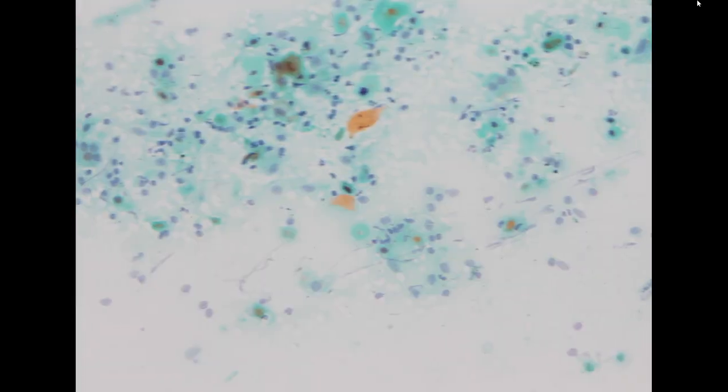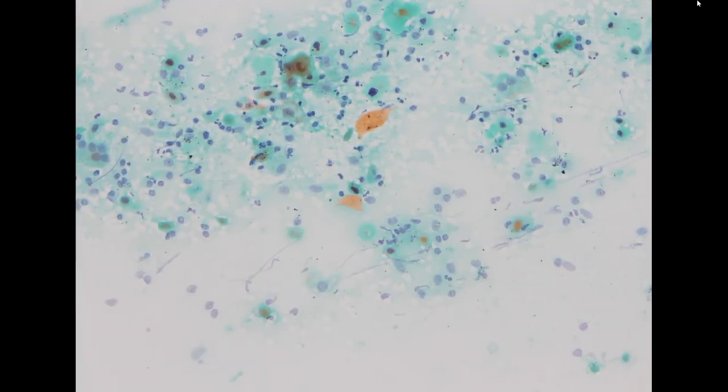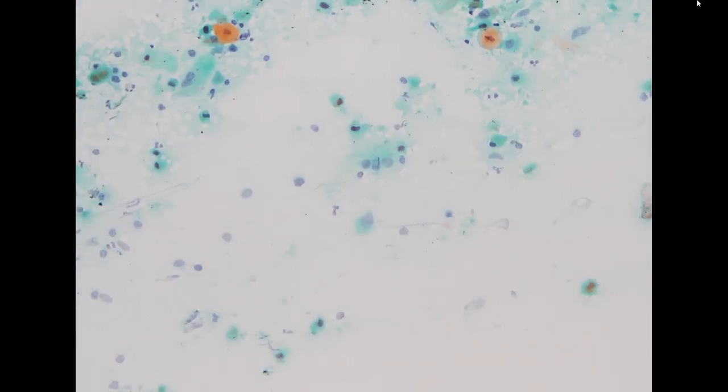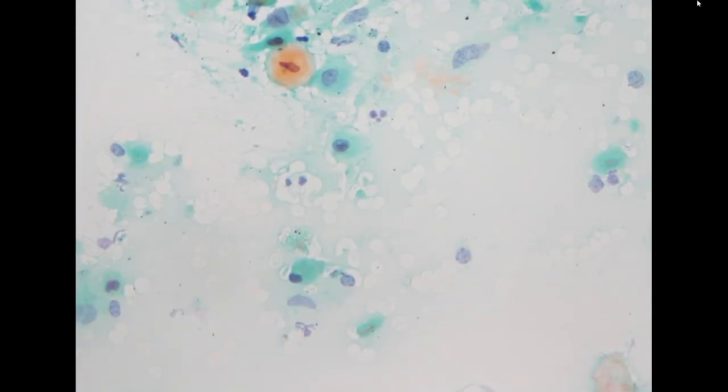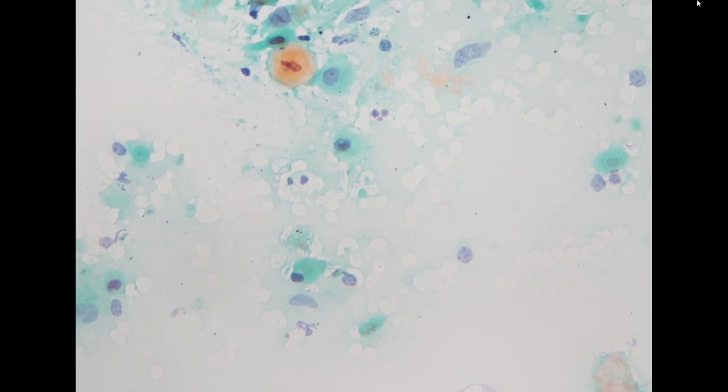So if it's a primary lung cancer, it is highly likely it is a squamous cell carcinoma, which is much less common than adenocarcinoma. However, the patient has the clinical impression of a kidney tumor, a kidney mass, which is really large, and this is suspected to have metastatic disease in the lung.